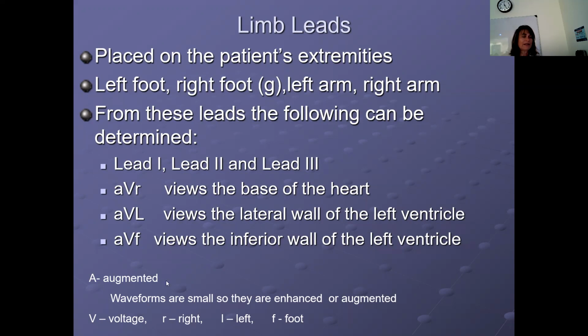So augmented, it says waveforms are small, so they are enhanced or augmented. So augmented means to increase in size. So the augmented V lead on the right, it will view the base of the heart.